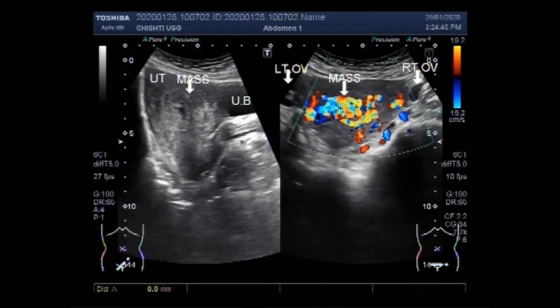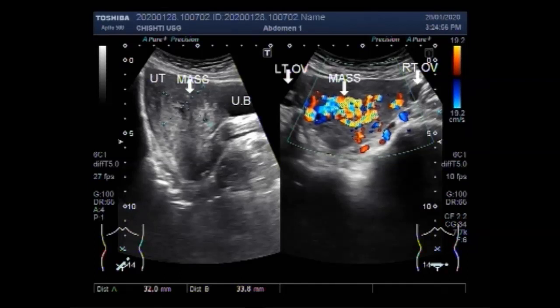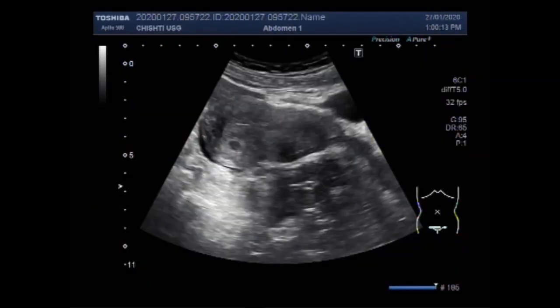Now you can see the measurement of the mass. This mass measures about 33.8 millimeters by 32.0 millimeters. Now we are going to see the second video showing a small uterine mass — a small fibroid.